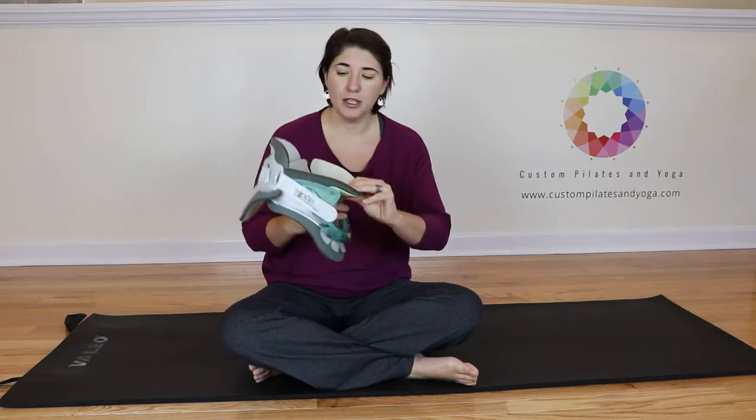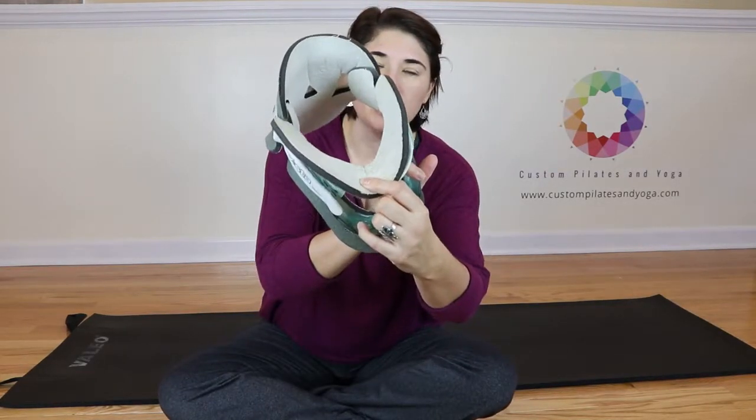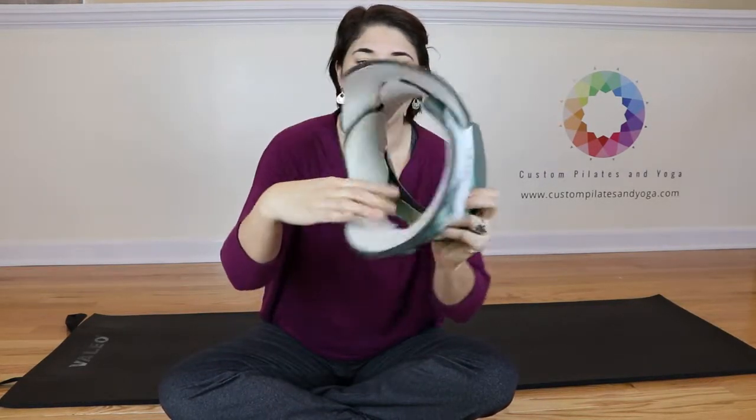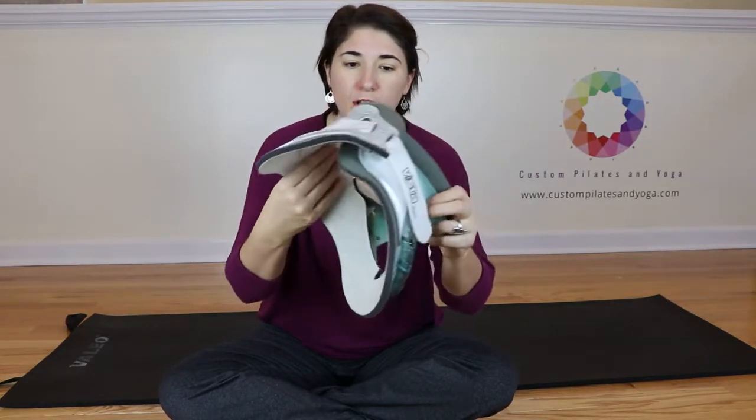So the collar has got three pads to it. You've got this pad here in the front top, you've got this pad here in the front bottom, and then this pad that goes along in the back.